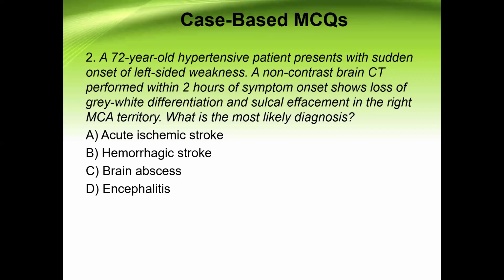You're correct. Which center are you from? Federal Medical Center, Abuja. Okay. You have a CT scan in your hospital? Yes, sir, we do. Beautiful. Okay, let's do the third one.